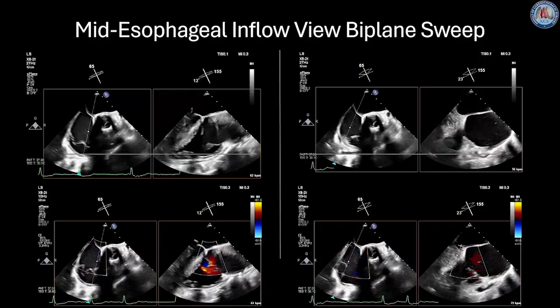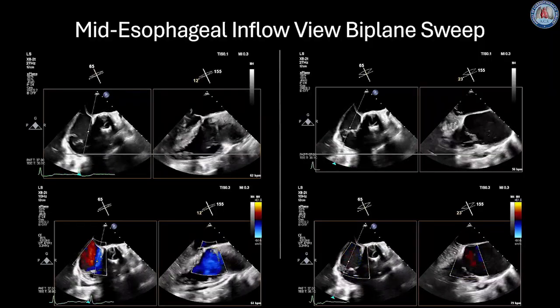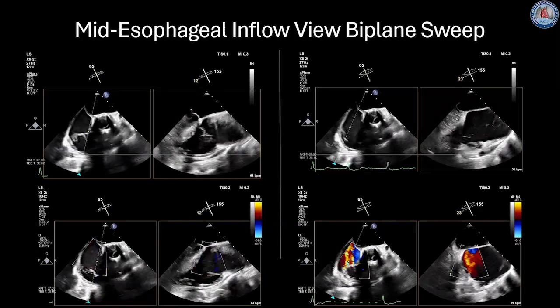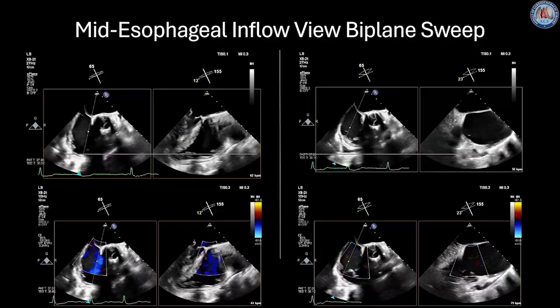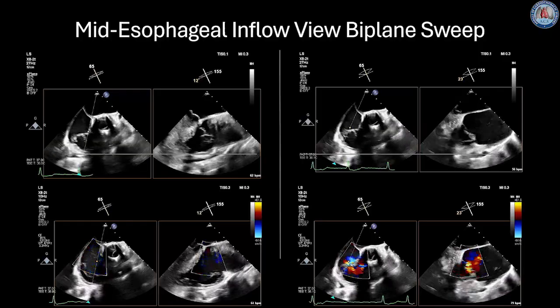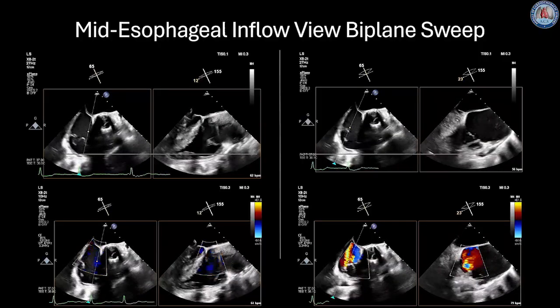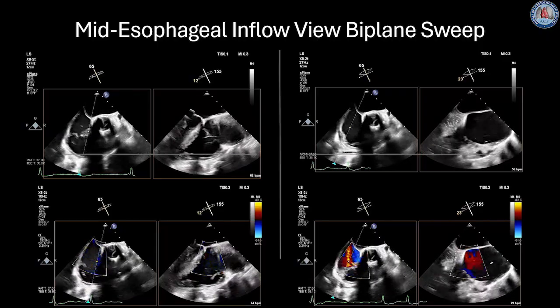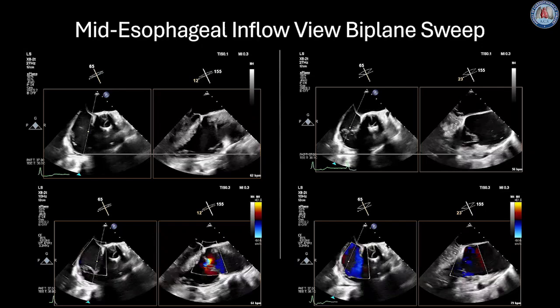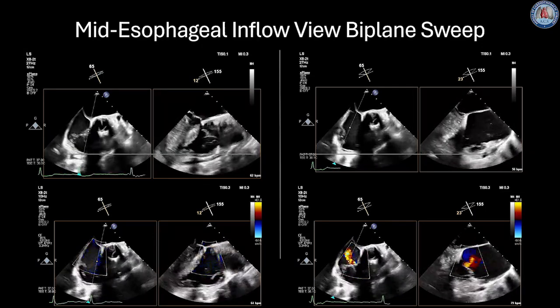Returning to the tricuspid valve, the optimal inflow view was selected by orienting the tricuspid annulus as horizontally as possible. This orientation allowed biplane imaging to transect the valve perpendicularly, such that the orthogonal plane represented the grasping view of the tricuspid valve leaflets. A sweep across the annulus in the inflow view was performed to identify the location of the tricuspid regurgitation jets, assess underlying leaflet pathology at the pathologic location, and measure leaflet lengths at the intended grasping location.